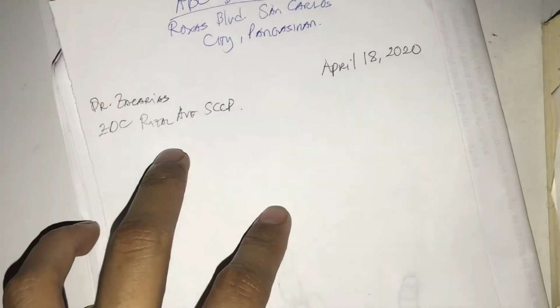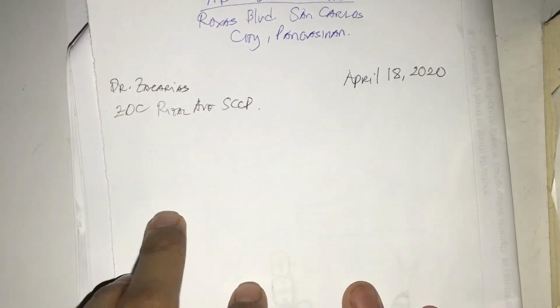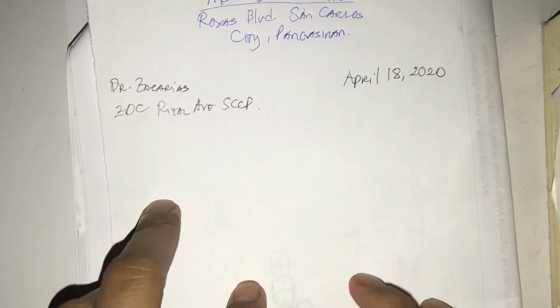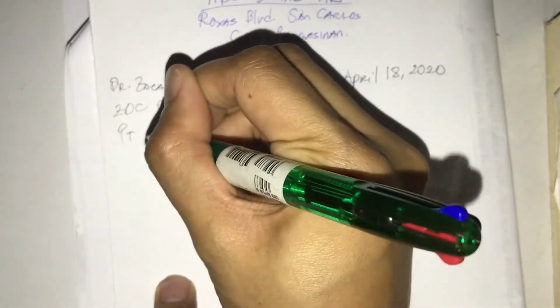2020. Yep. April. Like that. And then, after that, you're going to write the identification of your patient. So, for example, patient name.